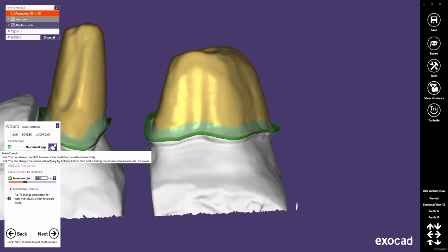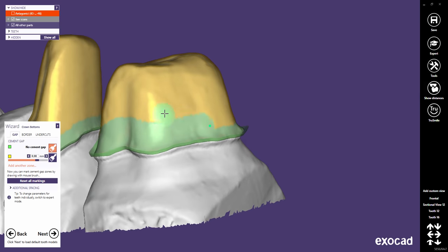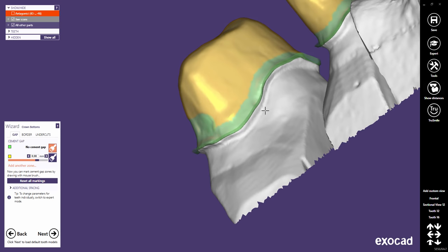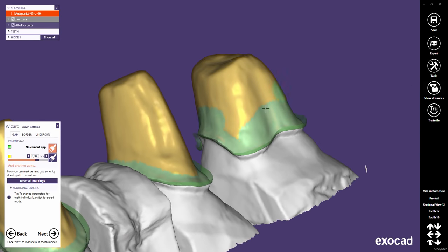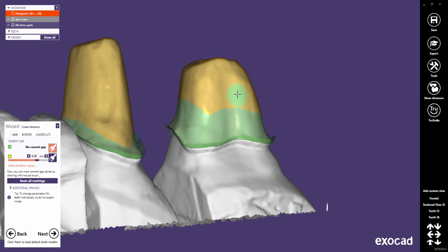Furthermore, both zones can be defined with a brush. Click on the Brush button for the zone you want to adjust. Let's try it with the No Cement Gap Zone. With Shift and the Mouse Wheel, you can change the brush size. Extending the green zone without cement gap in the margin area will certainly increase friction.